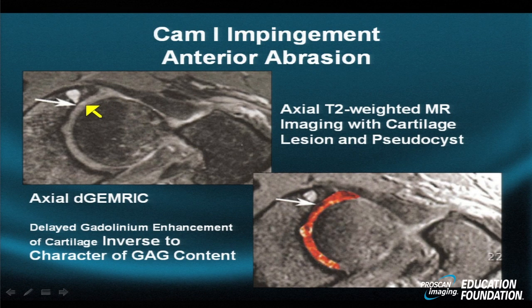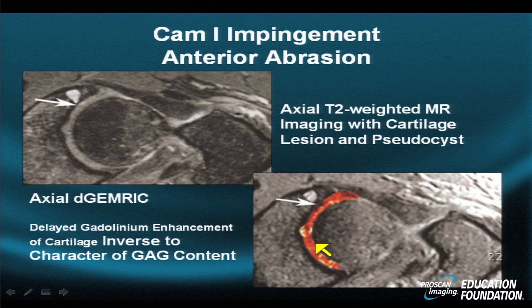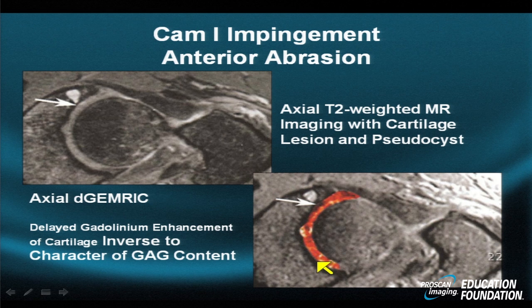Here's an axial T2-weighted MR showing some subtle irregularity and perhaps a little hyperintensity with a subcortical pseudocyst, but the true scope and nature of the hyaline cartilage disease cannot really be ascertained until one looks at the dGEMRIC examination with intravenous contrast injected, seeing the avidity of the gadolinium for most of the cartilage throughout. This avidity indicates marked depletion of the GAG or glycosaminoglycan content of the cartilage, allowing the gadolinium to diffuse inward.